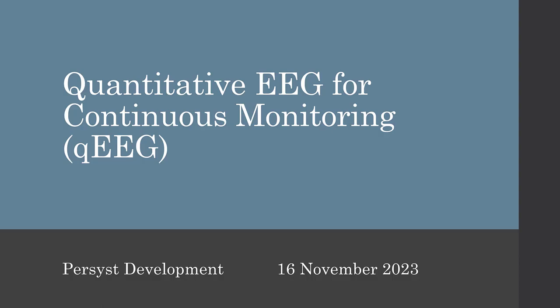Thank you for joining us for our discussion on Persyst 14 and quantitative EEG for continuous monitoring. My name is Michael Guess, and I am the VP of Research and Clinical Applications for Persyst. Today, we will be exploring quantitative EEG and detection technologies for EEG in the EMU and the ICU.